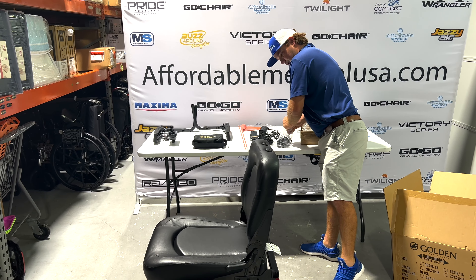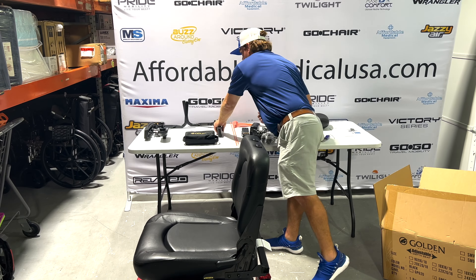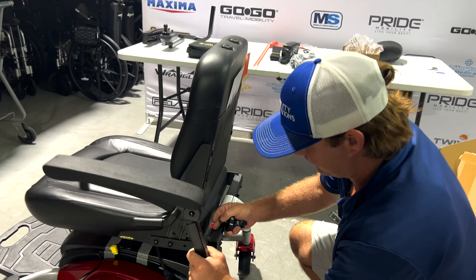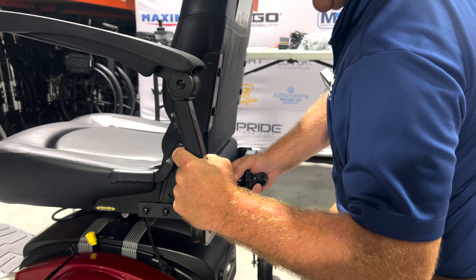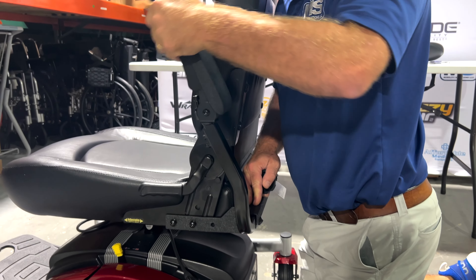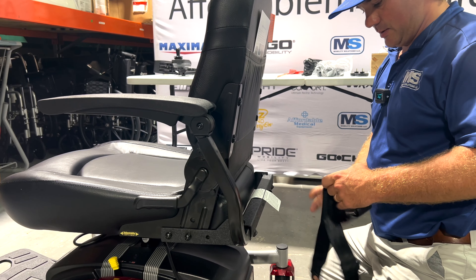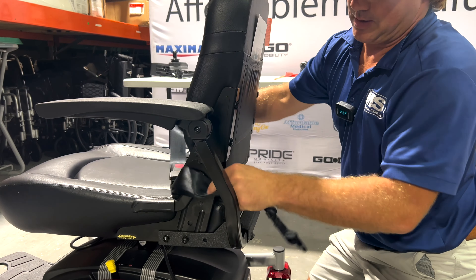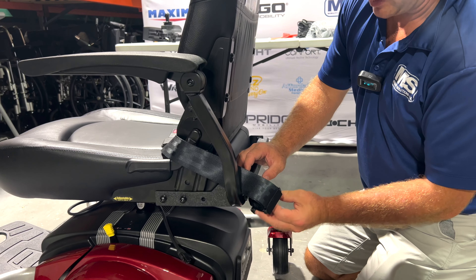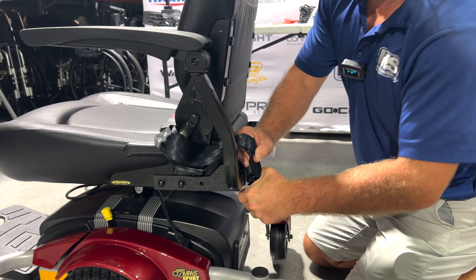Back here, we'll put the little knobs for the arms. This is going to be set up on our right hand. You can change the depth of these seats too — this is 18, I think you get the 20-inch depth. You're going to put this on like so. These are flip up. You can move this a little bit and adjust the angle and a little bit of the height. And if you need a seat belt, the seat belt would go like this — then you'll take these and tighten it up. You can also adjust the width.